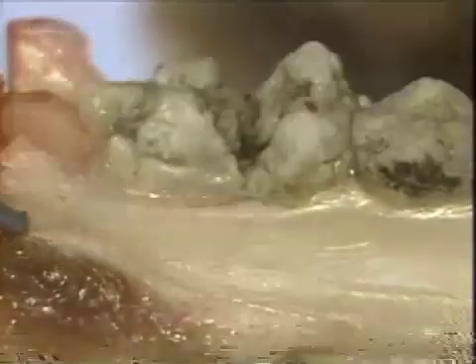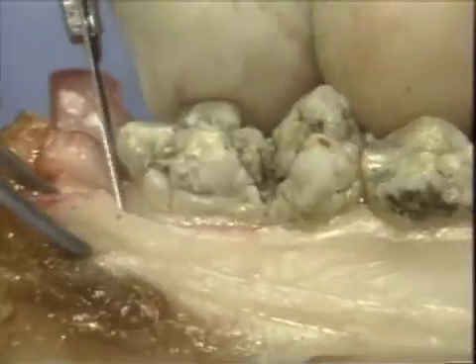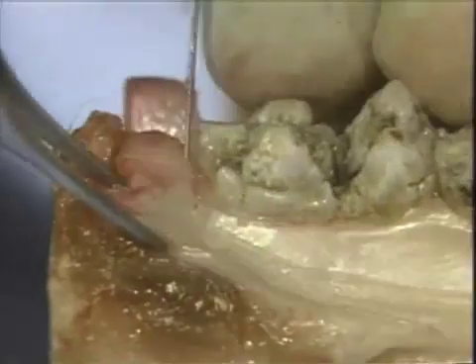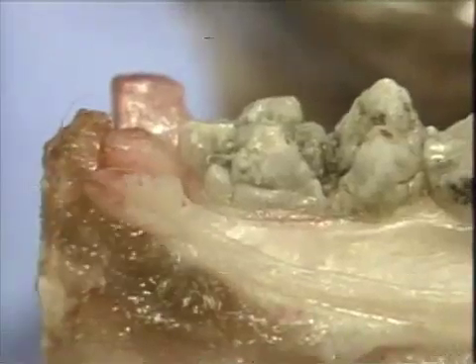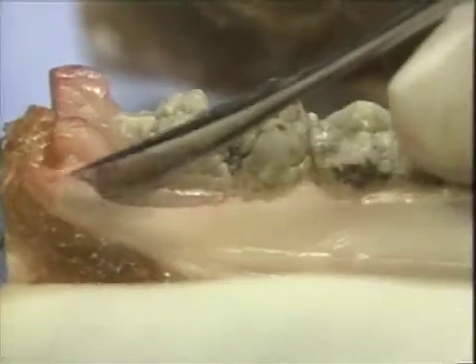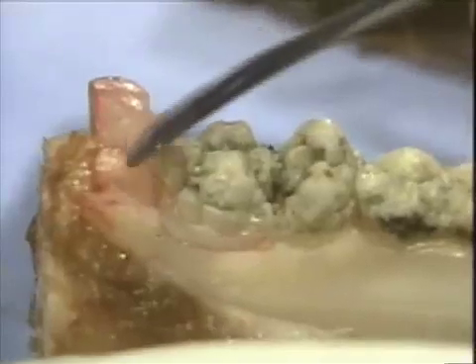The periosteum is incised in a continuous manner from the distal to the anterior portion of the flap. Now the distal wedge tissue itself is excised. It is released from the distal surface of the terminal molar tooth and then will be excised from its osseous base. This should only be accomplished after the lingual and buccal flaps have been reflected in order to allow the operator to visualize this distal wedge tissue.